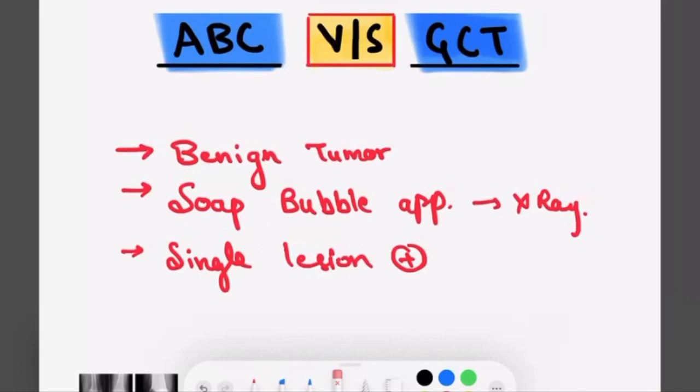Hello everyone, welcome to MBCs.com. In this video I am going to tell you about how to differentiate between X-rays of ABC and GCT, that is aneurysmal bone cyst and giant cell tumor.